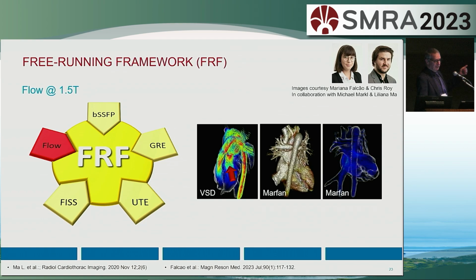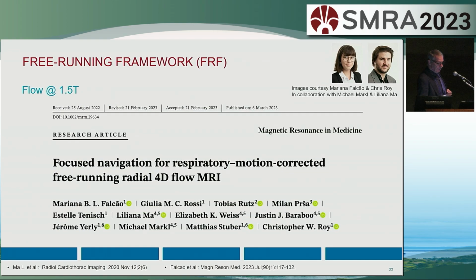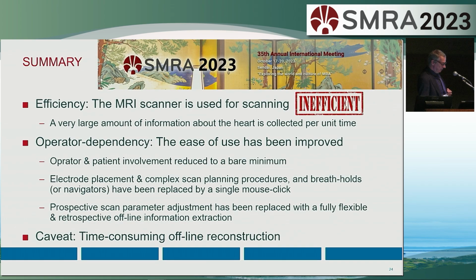If you're doing this like here in 5D, the scan time is always constant, no physiological parameter affects scan time anymore, and you can get out these data in about 8 minutes. And here is one of the papers we were fortunate enough to write together.